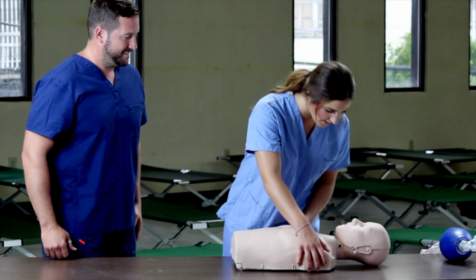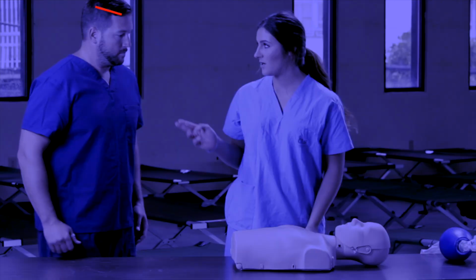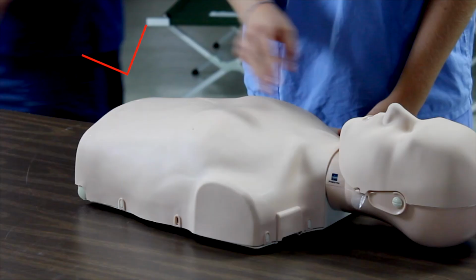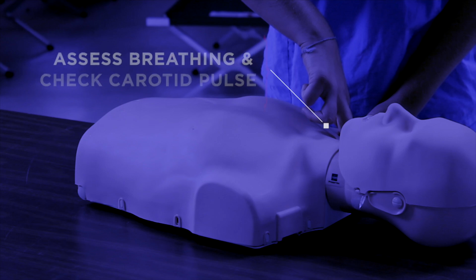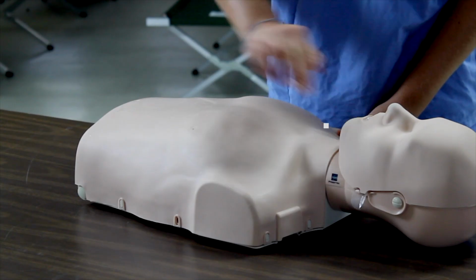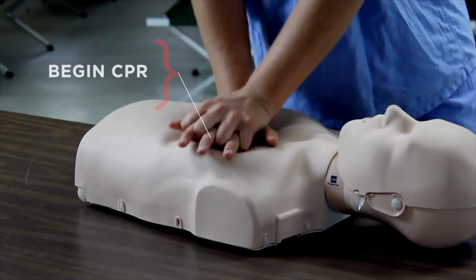If the scene is safe, approach the victim and assess their responsiveness. Send the other person to activate the emergency response system and get an AED. Assess breathing and check the carotid pulse. If the victim is not breathing or only gasping and has no pulse, begin CPR starting with compressions.